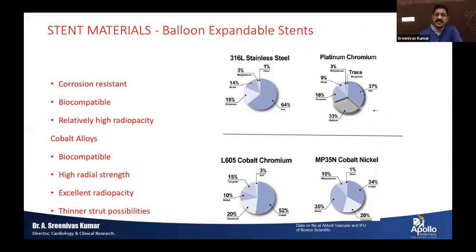So stent material is another thing. Balloon expandable stents, you have stainless steel, platinum chromium, cobalt chromium.